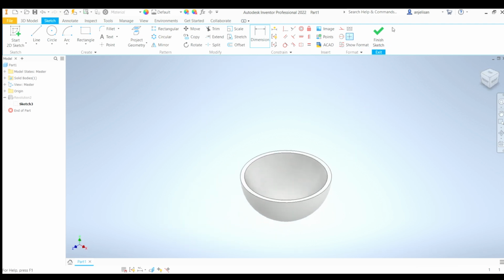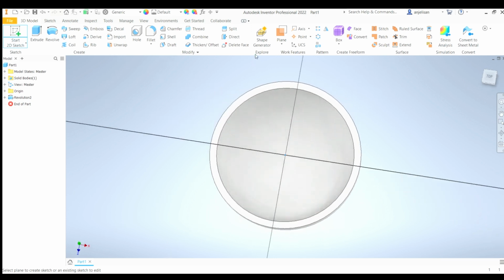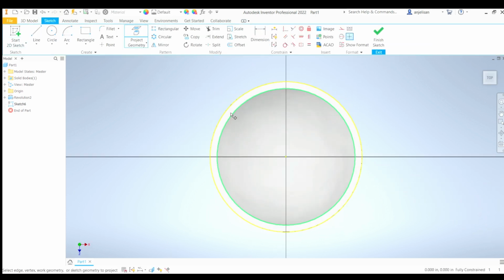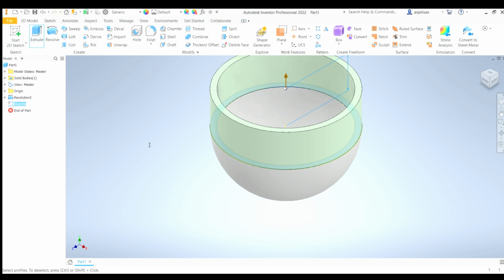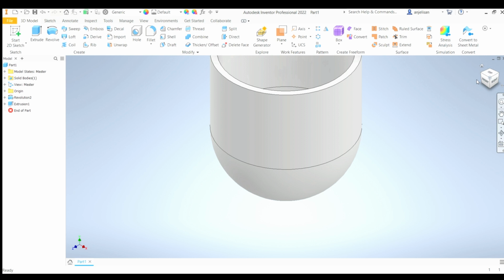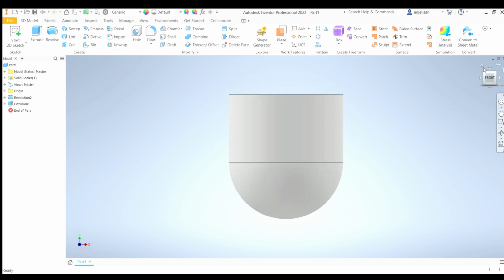So yeah, I forgot that part, and I'm just going to redo what I did before, which is again adding some height to this. Start a 2D sketch on this face, project the geometry, and then extrude it upwards after selecting it, of course. So let's say we want 2 inches, I don't know. Let's go crazy. Okay, so awesome. Now it actually has some sort of structure to hold the leg. Okay, that's great.